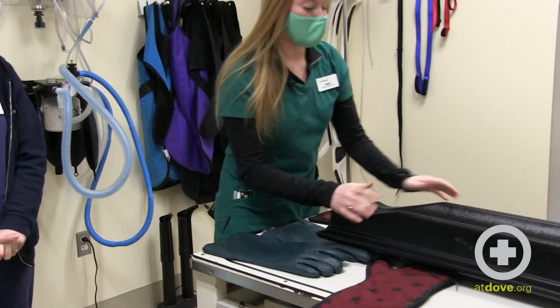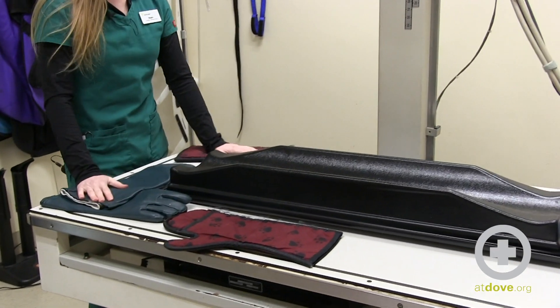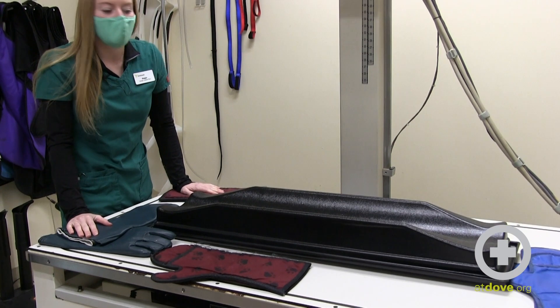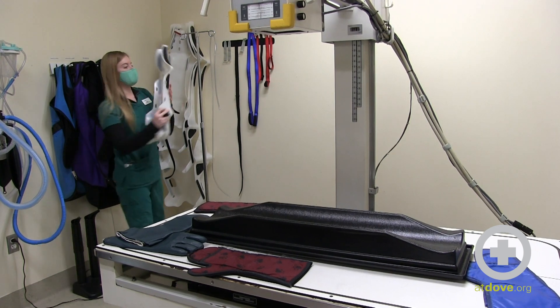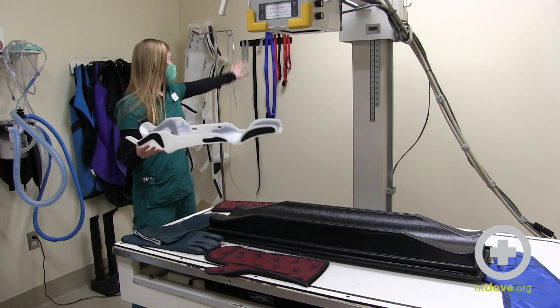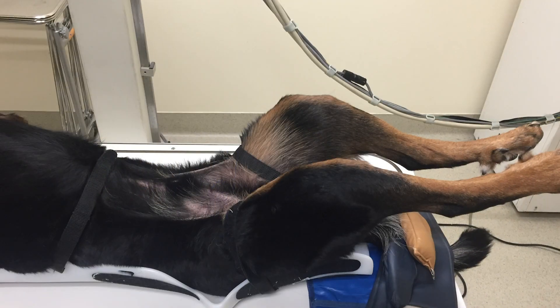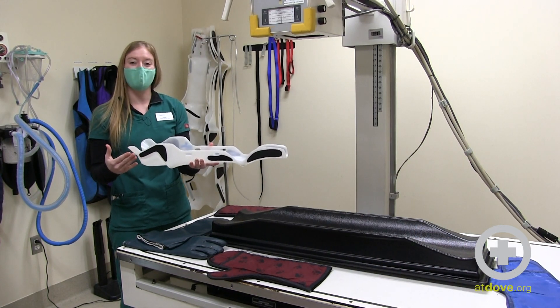We also have a trough that you'd want sitting flat on the table — used for a VD aspect image, where the spine of the animal lays down and the feet are up in the air. Another tool I really like is called the positioner, which comes in a variety of sizes. We have plenty of velcro straps that can be threaded through in a bunch of different ways to achieve the restraint needed for the image you're looking for. There are great videos on how to use the positioner available online and through their website.